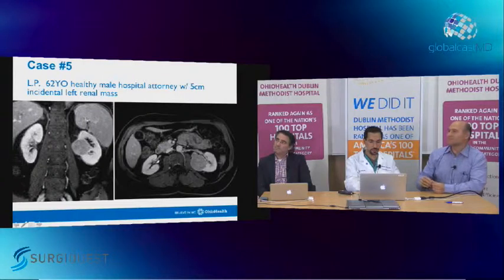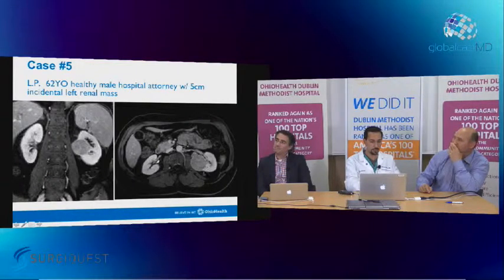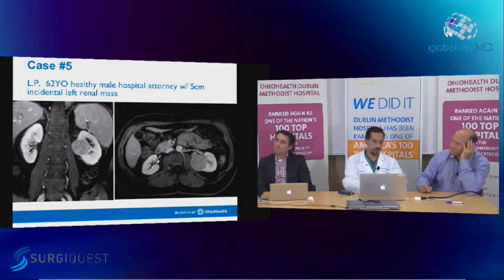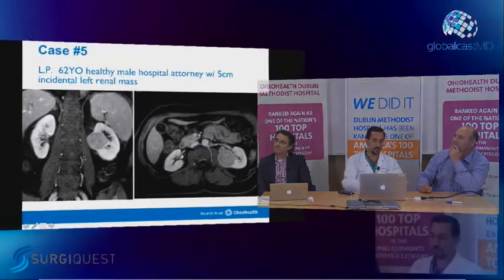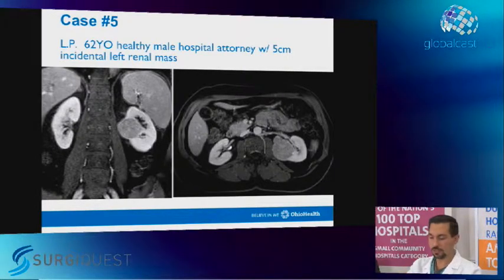Yeah, I think to illustrate that here on the screen, this plane right here, there's just a sinus fat plane here, and you can dissect that all the way as deeply as you can, and then really you're just cutting this part. Right. And of course it's a C shape, because we're looking at it in the axial view. Right. But it's going to be a C shape, so you're going to be cutting here and then all the way around like this, you know, above it and below it. But really, like you said, there's not a really big parenchymal defect when you're done. You just see basically the sinus fat in the middle and then this C-shape horseshoe kind of configuration of parenchyma.